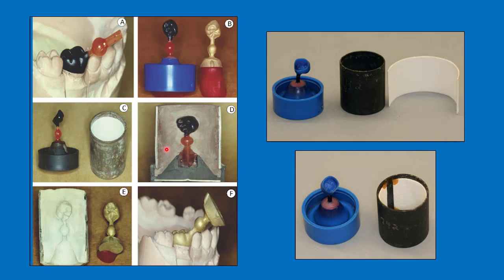The casting ring with the wax pattern and crucible former are poured with investment. Then they are heated in a procedure called the burnout procedure, in which all the wax of the wax pattern and the sprue are removed or burnt, leaving the shape of the crucible former, the sprue, and the wax pattern as a mold. During casting, the metal is forced through the crucible former and pushed through the sprue to occupy the space of the wax pattern. We then check the result on the cast, and if it is acceptable, we remove the sprue and finish the crown.